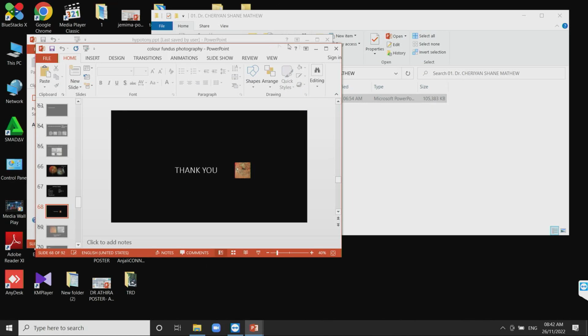Thank you, Dr. Shane. One question, how often do you ask for a multicolor image in your routine practice? Or clinically, how useful is it?